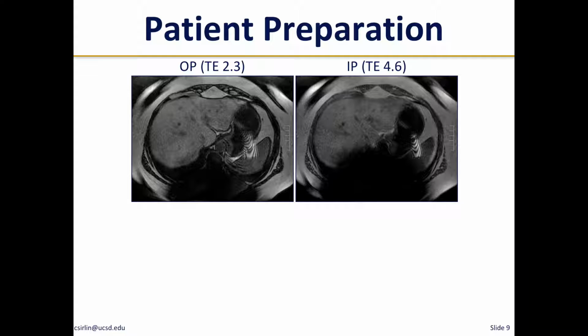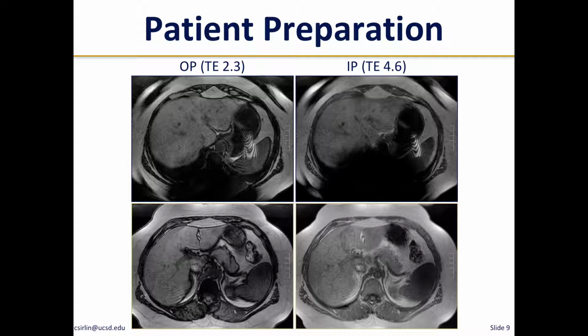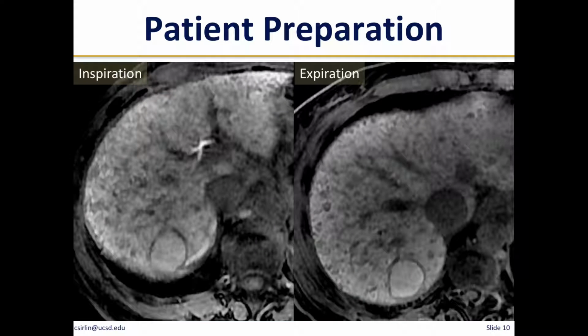So women should either have bras with no metal clips or just no bra. So that is just patient preparation. And when you remove the clips, then you get images like this. So with no knowledge of physics, with no knowledge of all of that complicated stuff, simply preparing your patient takes you from images that are almost uninterpretable to images that are of reasonable, good quality.